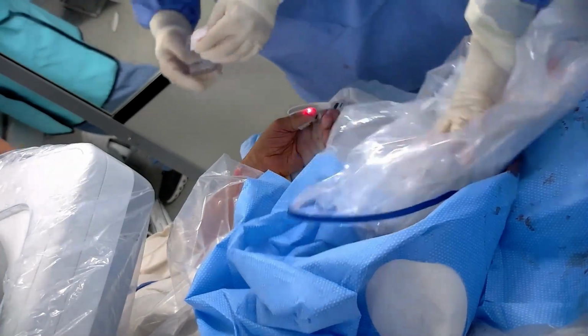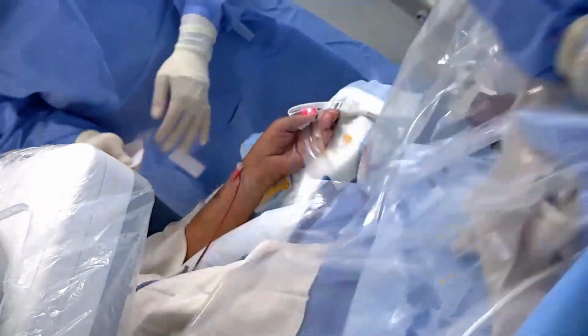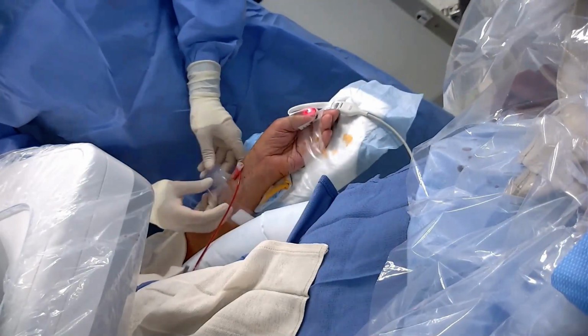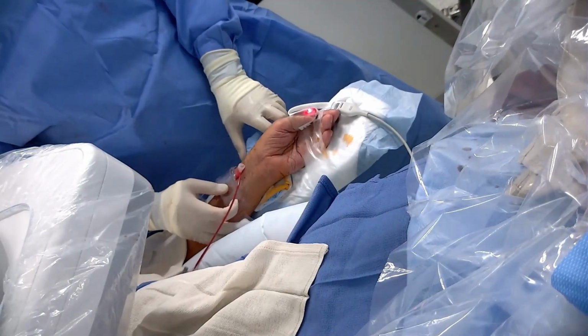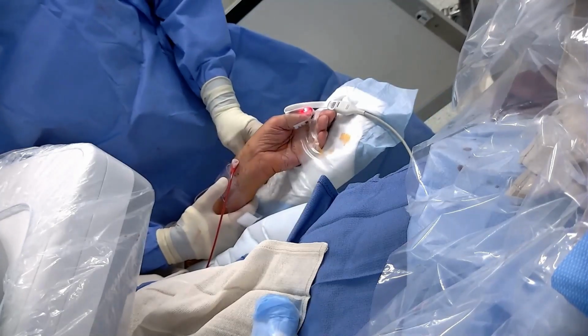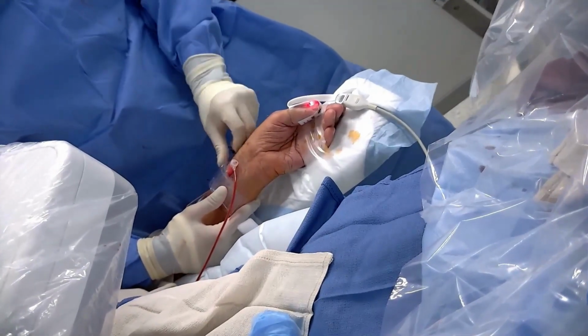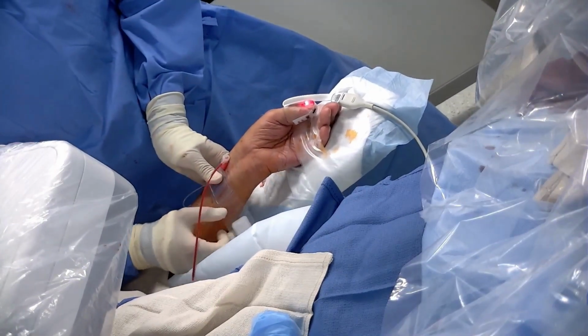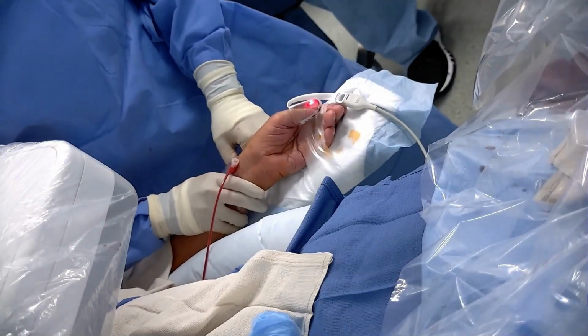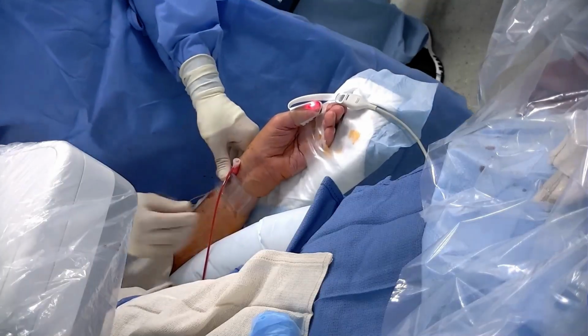Here's this TR band. And then I know they have that proprietary syringe. How do you secure that in a way so we send it to PACU? How do you prevent that from being lost, so to speak? So we'll tape it to the patient's chart. We used to tape it to the patient's forearm, but now we just tape it to the patient's chart. That is one of the more annoying things about the TR band, the proprietary syringe, because you can't just use a regular syringe. So if you lose it, you kind of have to open up another band. I think it's a scam.